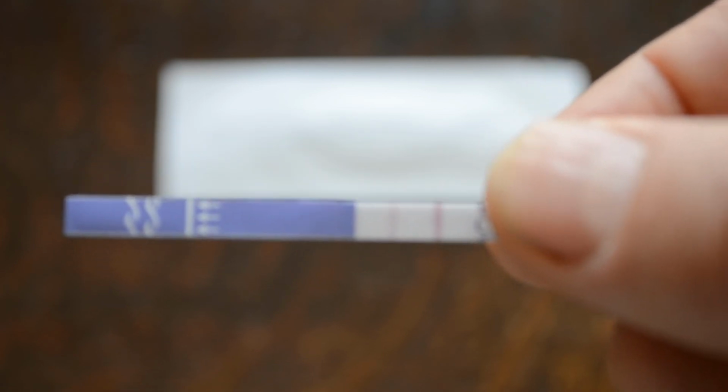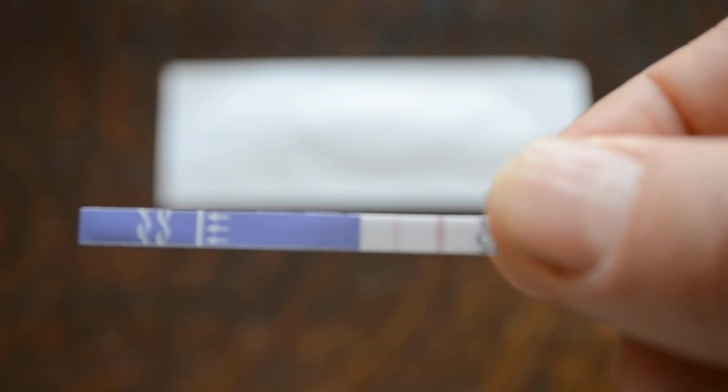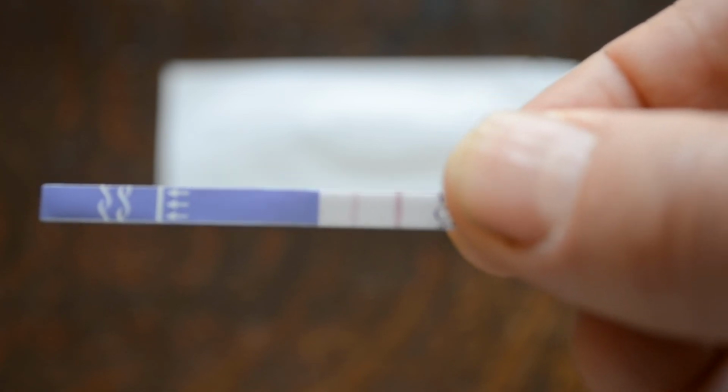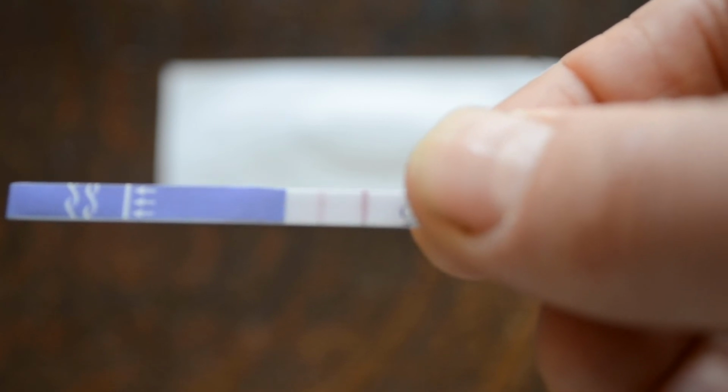Now, we're often asked, the test line looks different from the control line, what is the significance of this? And as long as a test line is formed, no matter how thin or faint it is, you must interpret that result as a clear negative result. You must not try and draw any conclusions from the colour saturation, density or thickness of the test line. Two lines negative, one line positive.